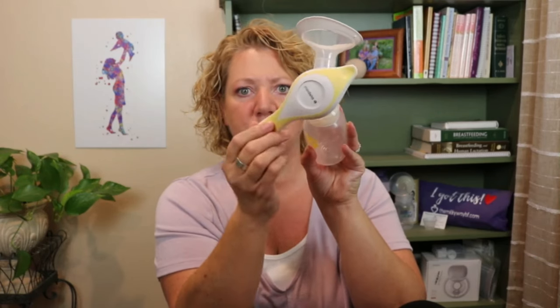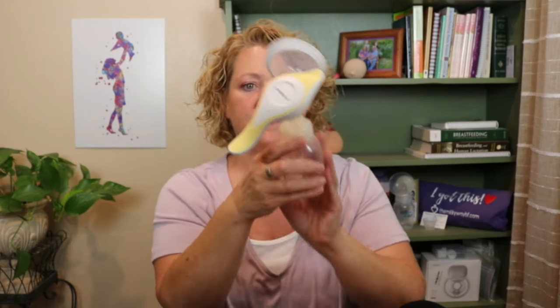On the Medela manual pump, the flange is an oval shape and you can rotate it — keep it in one direction or turn it however is most comfortable. The handle also moves, so whatever position is most comfortable works just fine, whether you're pumping straight on or from the side.